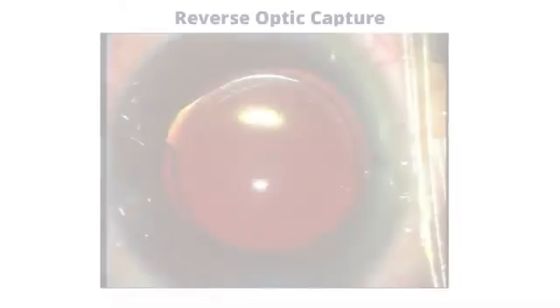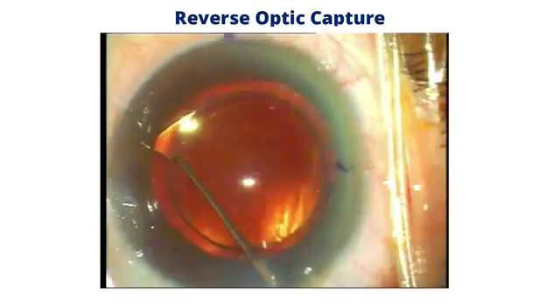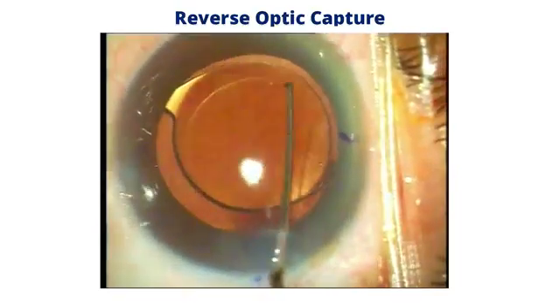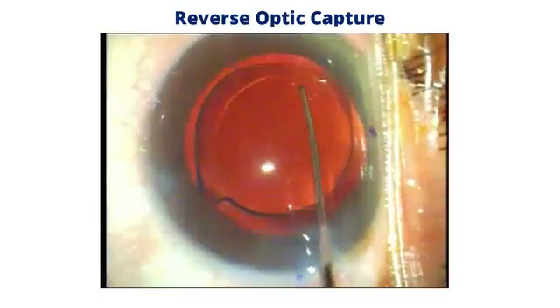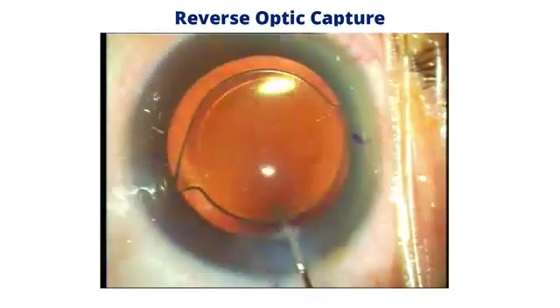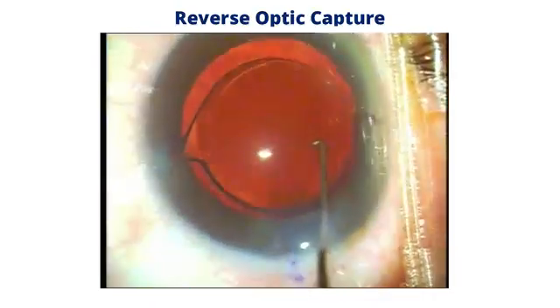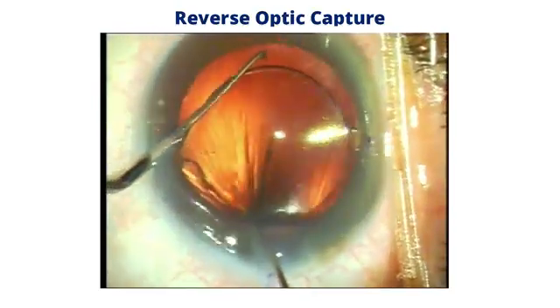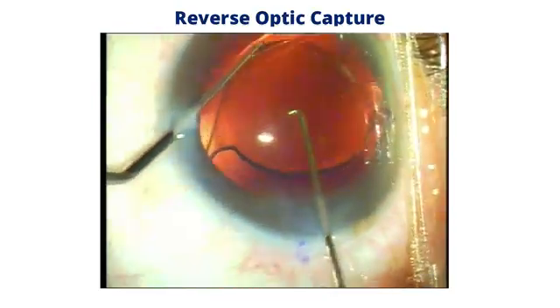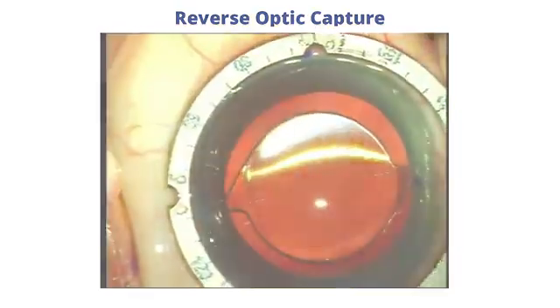So this is a video to show you how you can do a reverse optic capture in this high myope. Now this is played really fast because I'm just showing you rotation to the desired axis, and that this lens really is spinning very freely. And what you do is get it to the right position, and then with 2 Sinskey hooks, you just lift the lens forwards to capture it. Of course, you need to have a rhexis that's smaller than the optic and well-centered.